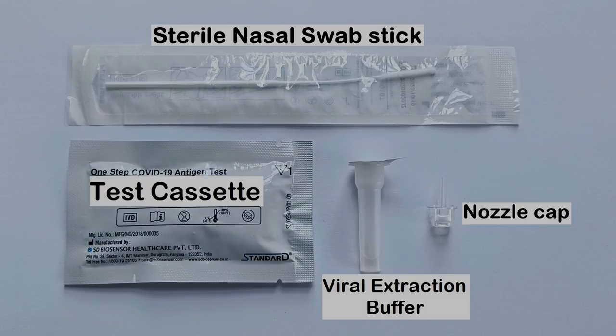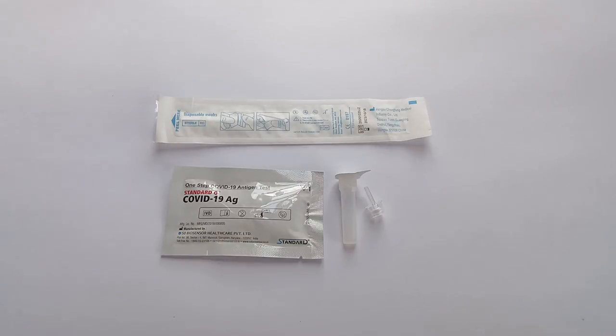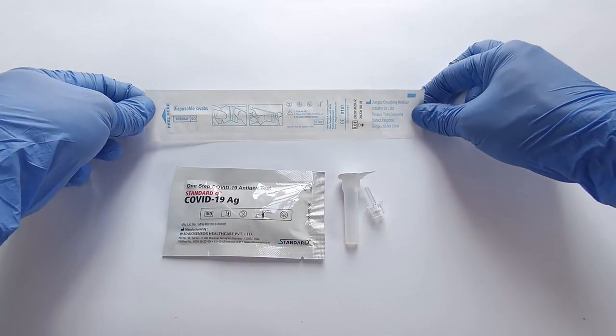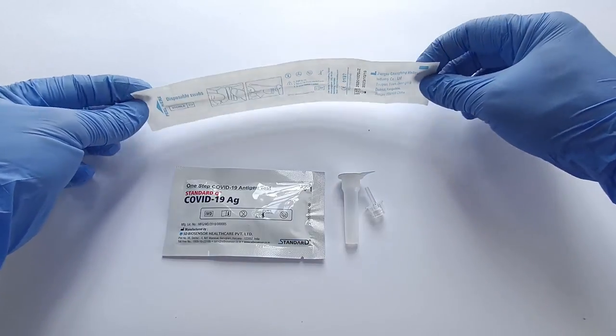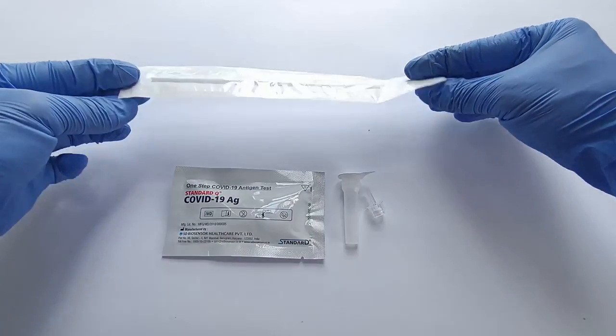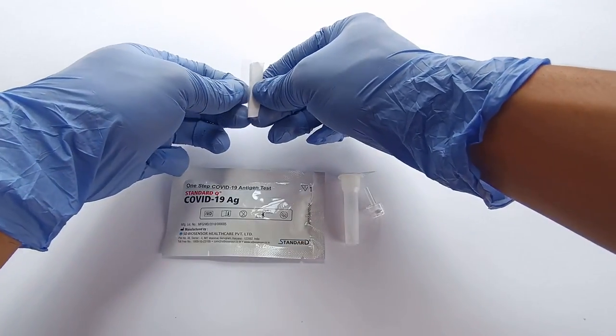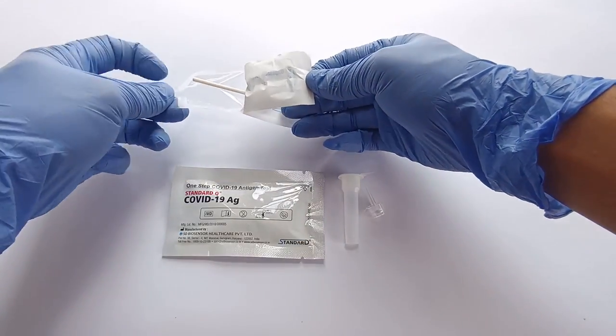To begin the RAT test for SARS-CoV-2 virus, open the pouch containing the sterile nasal swab stick. Make sure to follow the instructions on the pouch and open it from the side containing the end of the swab stick handle, and not from the side containing the cotton tip. Carefully remove the swab stick from the pouch.